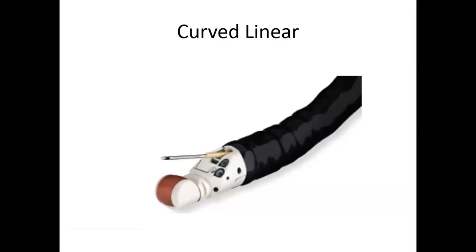The good part with endoscopic ultrasound is that we are able to do various procedures. We can see a needle at the end here, which we can use either to inject drugs, to get specimens, or to insert a stent. We can do all sorts of procedures with this instrument channel. Then we can also see the camera system and the light, which will direct us when we are entering the gastrointestinal system. I'll share a video at the end, hopefully, so that it makes more sense about what I'm trying to say.